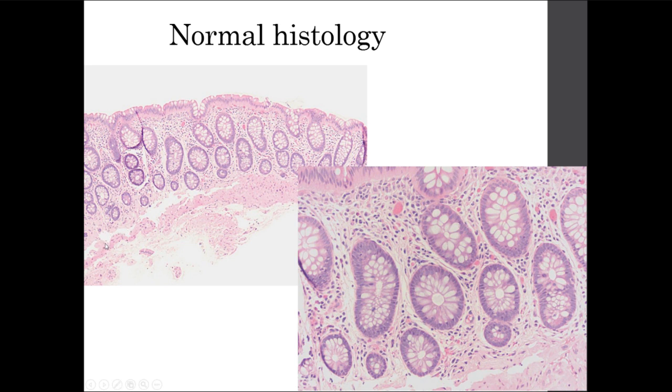So in a very brief way, I will say that the colonic mucosa will have an even distribution of crypts. So they are equally spaced pretty much. They have different shapes, but pretty much rounded on cross-section. The epithelium on the surface is intact in this case with abundant cytoplasm and goblet cells that are obvious. They're also present in the crypts. The lamina propria is variably cellular. Let's remember that the cellularity on the right side of the colon is more prominent. The lamina propria becomes less cellular as we move towards the distal aspect of the colon. All the crypts are pretty much touching the muscularis mucosae in this case, which is normal, right?